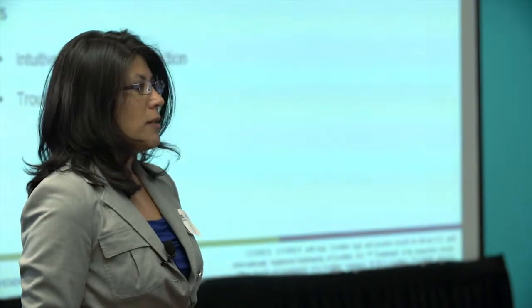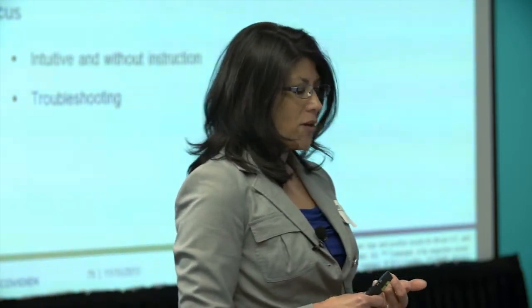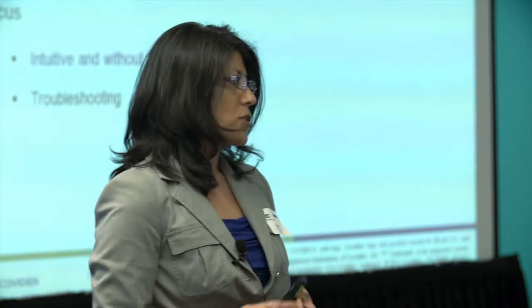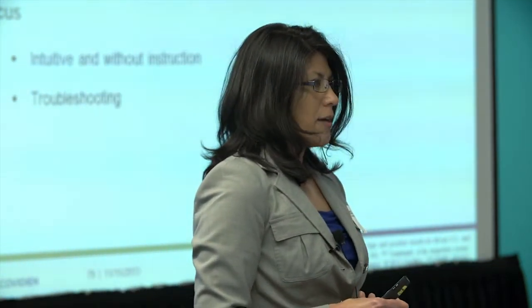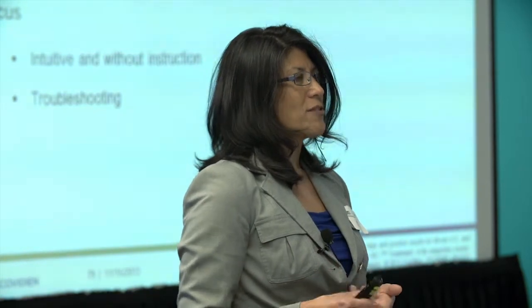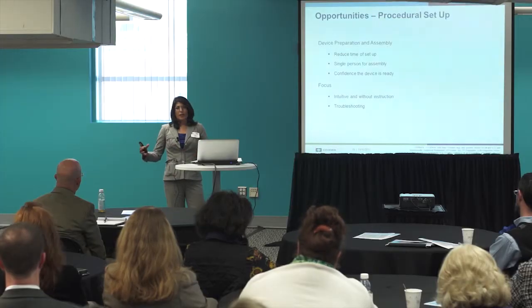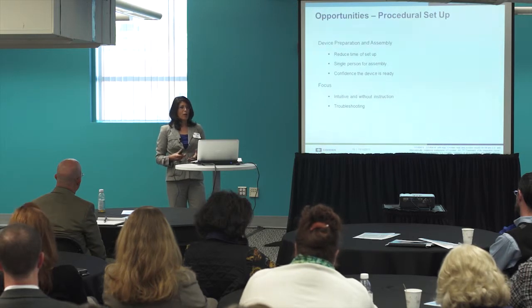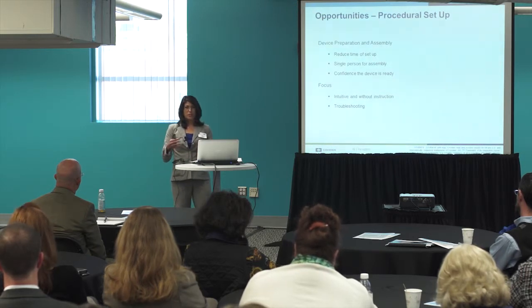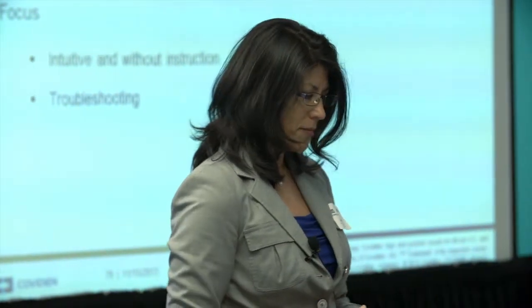So we went about this with multiple design iterations. We went from foam core models to SLAs to functional devices to finally the manufactured parts in our testing. We did several rounds of testing. We started out locally and then kind of grew that worldwide. We allowed the user to show us how things were done, how they would intuitively put parts together. So we'd basically say, here's all the parts, can you make it look like this? Kind of like a puzzle.